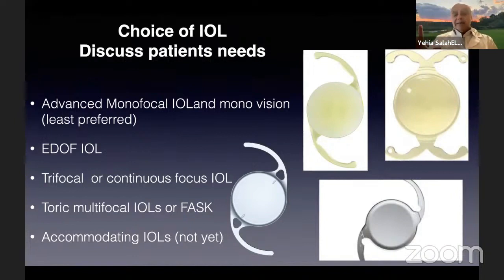Usually, extended depth of focus or extended range of focus lenses are very useful in many situations, but you have again to customize it to the patient's needs.